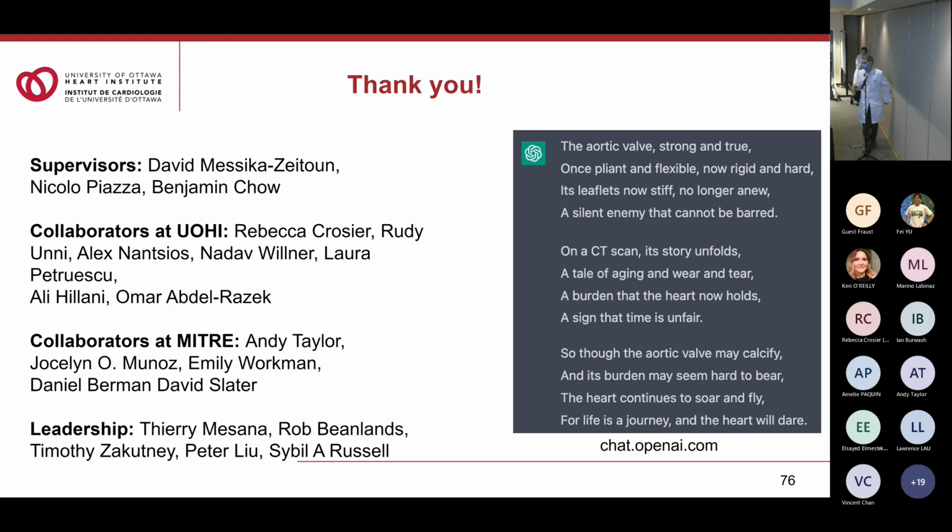Yeah, that's a great point. And of course, you want to have data that's as representative of the population you're describing. And definitely our data set was more heavily biased towards more severe aortic valve calcification score, but we did have a significant portion of the data set that was at the lower end of the calcium score, and we did do an analysis, and I didn't have time to present that, but we did stratify our evaluation or quantification of the accuracy of the algorithm by calcium score.